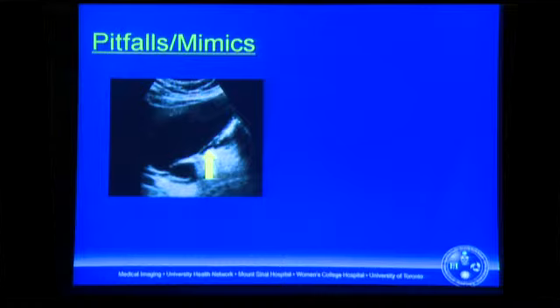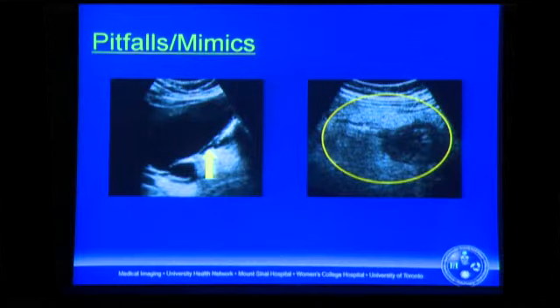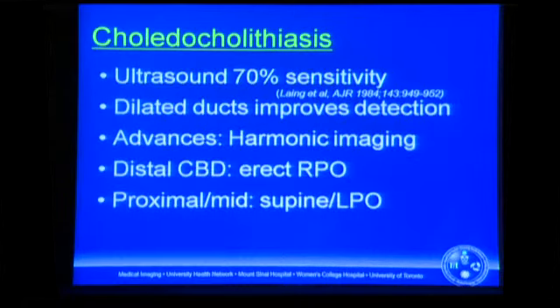And when you placed the probe where this patient was most tender, it was actually infralateral to the gallbladder, and we got this image of a very thickened hepatic flexure of the colon with an inflamed diverticulum which is perforated. You can actually see a tract there of extraluminal gas, and this is focal perforation of acute diverticulitis of the hepatic flexure of the colon.